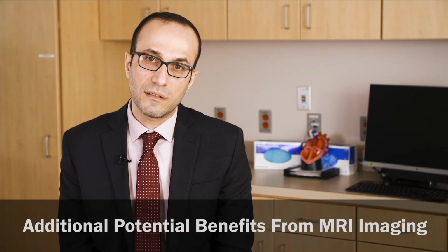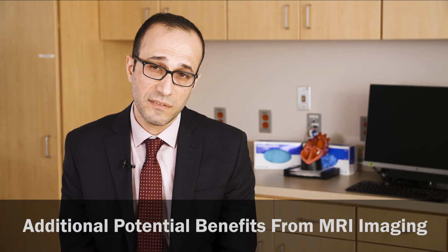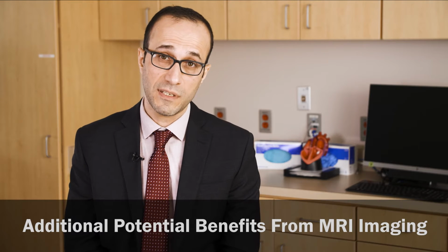One additional benefit of the MRI in imaging for prostate cancer is that it has a good sensitivity and accuracy in looking at the lymph nodes in your pelvis and looking at the bony structures. Additionally, it may have some benefit in looking at the lesion and seeing if that lesion is completely confined inside the prostate, meaning that it did not cross the boundaries of the prostate, or if it started doing so and invaded some adjacent structures such as the bladder neck, or the neurovascular bundle, which are the nerves that convey signals for erection, or the sphincter that controls your urine. And this may have a significant impact sometimes on the decision-making process related to the best management strategy that you may need.